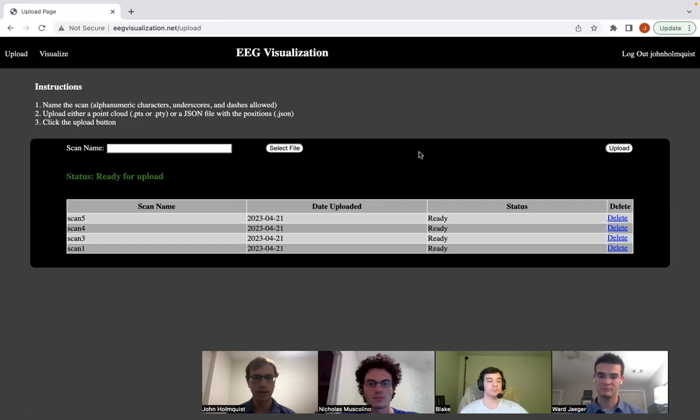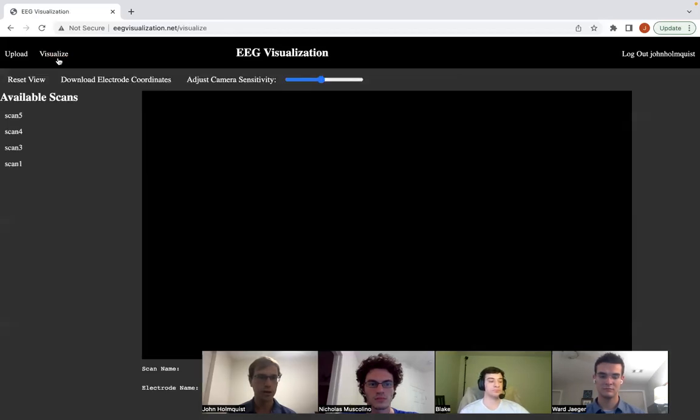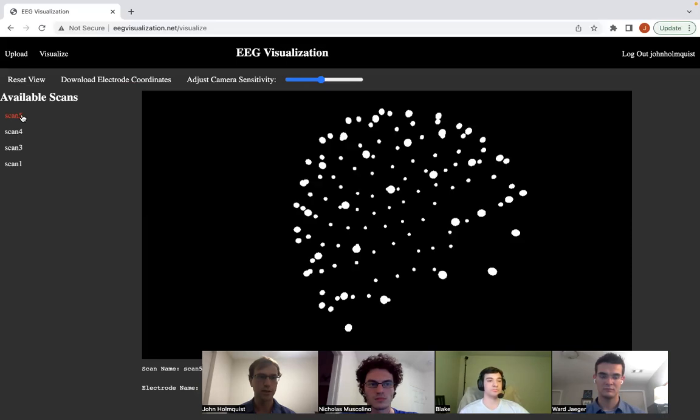You'll notice that in the uploads, there was some error checking in case you don't enter a scan name or you don't select a file. You can also delete scans. And then when you go to the Visualize tab, you can see that all the scans are available to visualize.